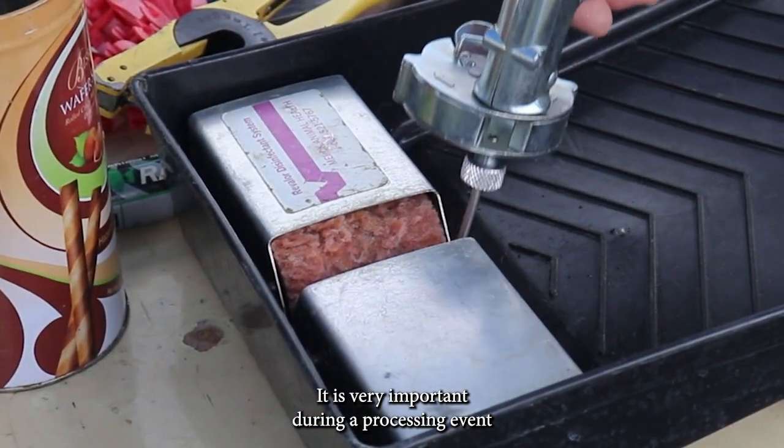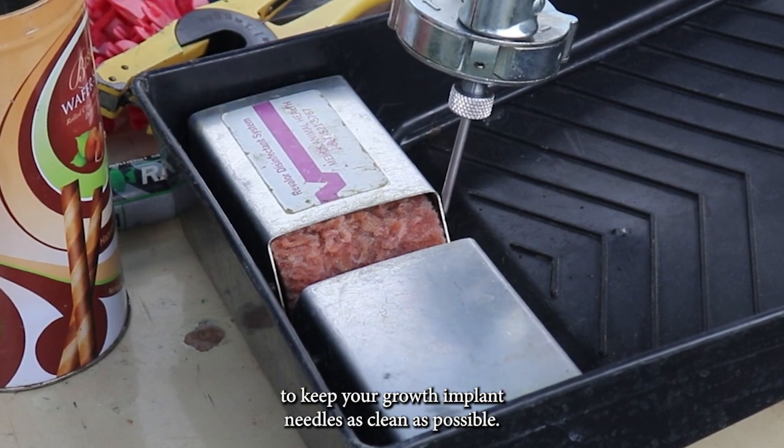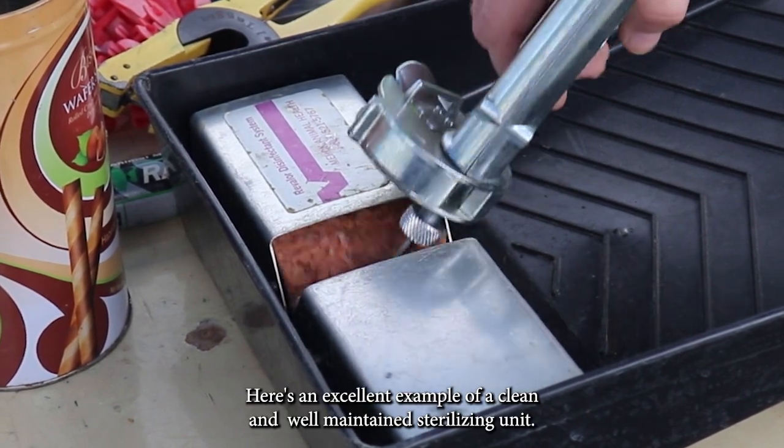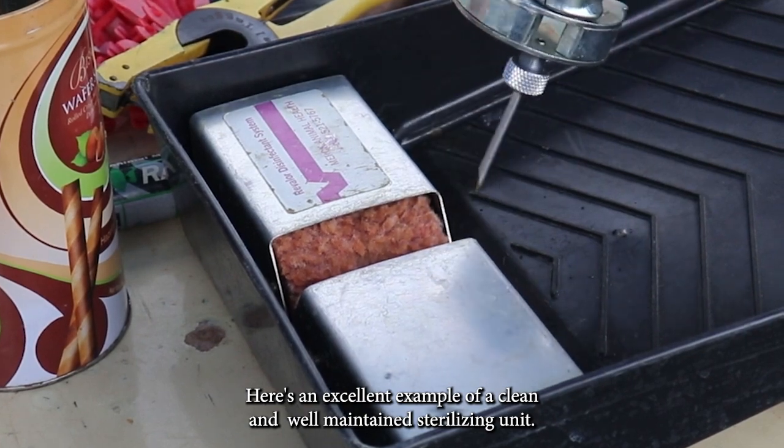It is very important during a processing event to keep your growth implant needles as clean as possible. Here's an excellent example of a clean and well-maintained sterilizing unit.